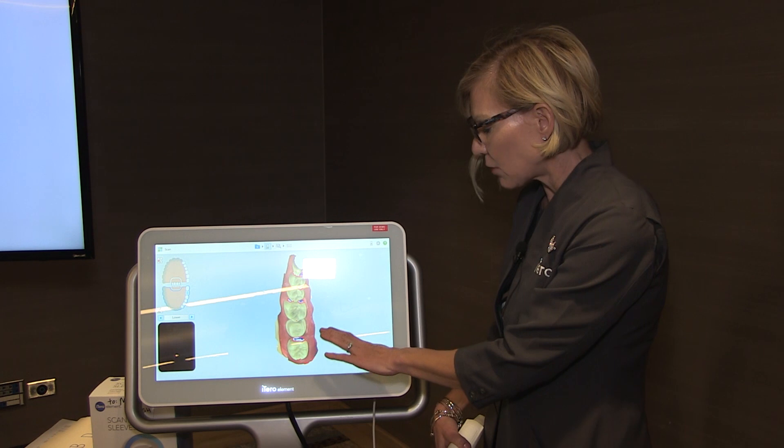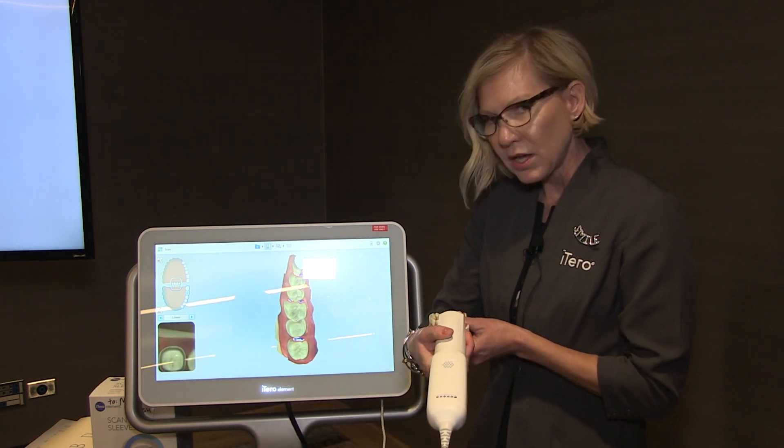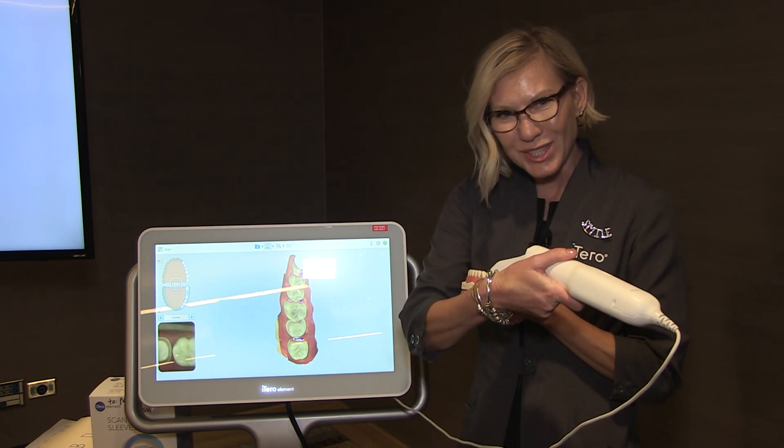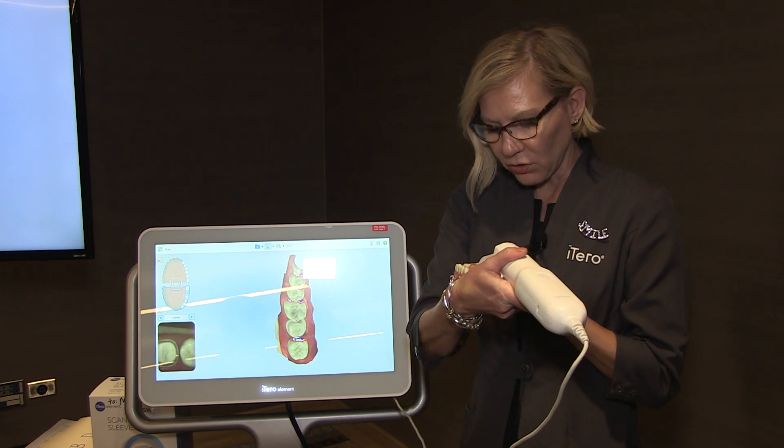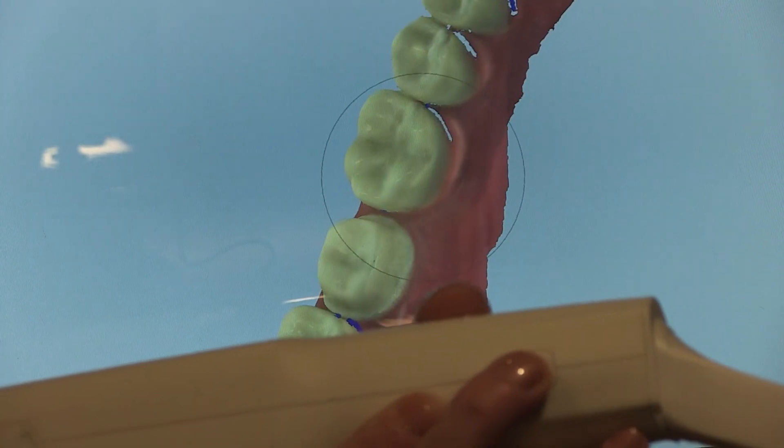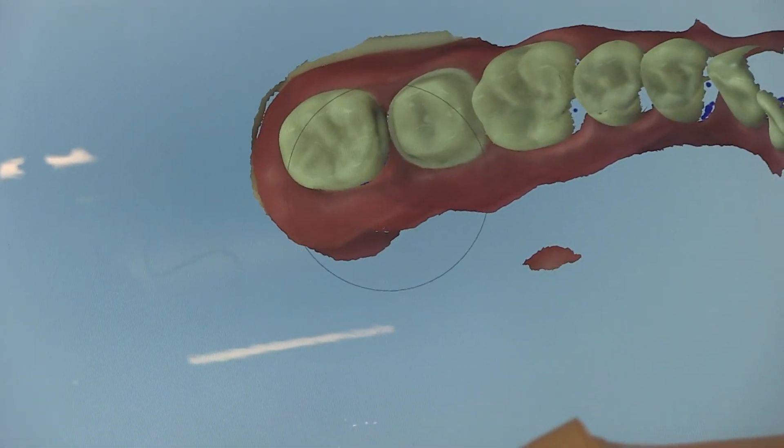So it allows me to capture just that voided area without capturing any additional information. And then if I bring the wand out to the side, rather than directly into the mouth, I can angle the lens so that it points back. And as you can see, it fills in that distal contact with tooth color. And then I'll roll forward and capture the mesial contact there.